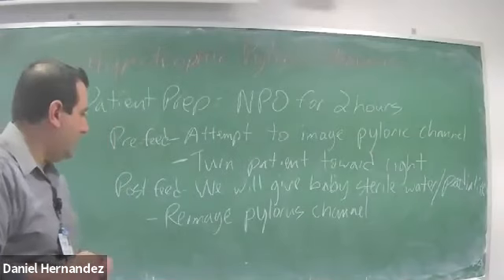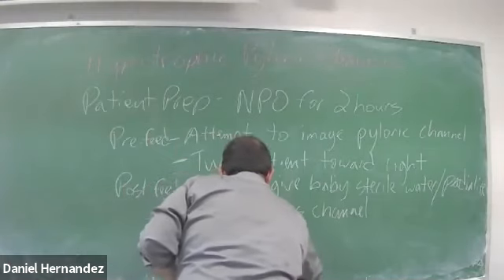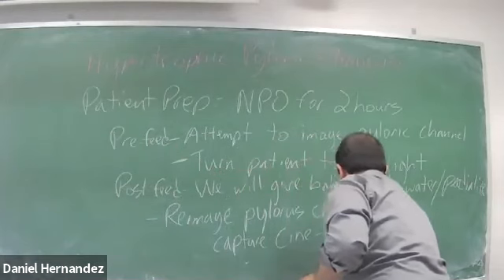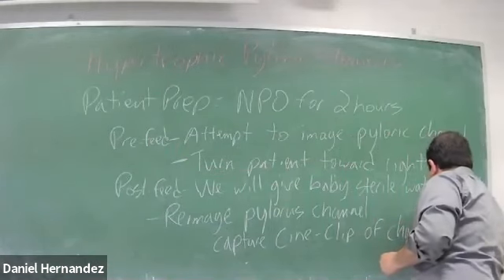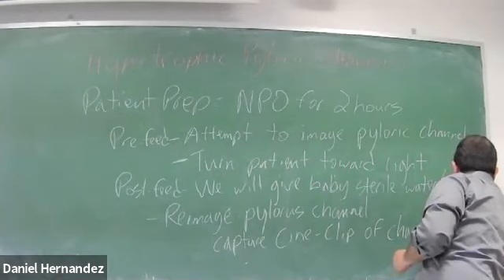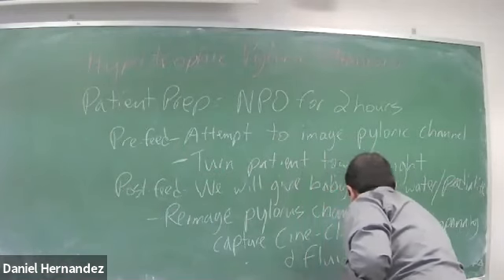You're going to want to try and get a cine clip, so capture a clip of the channel opening and fluid passing through.